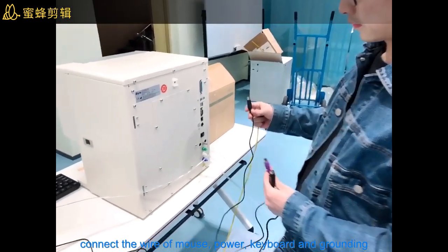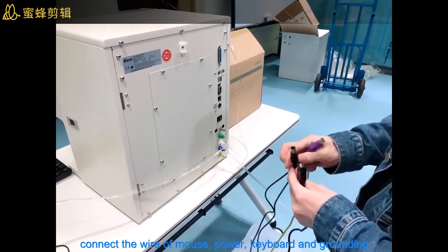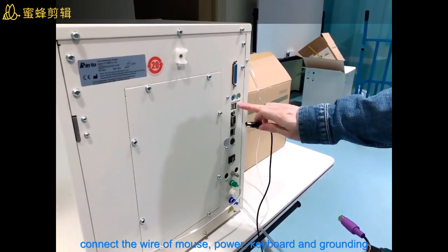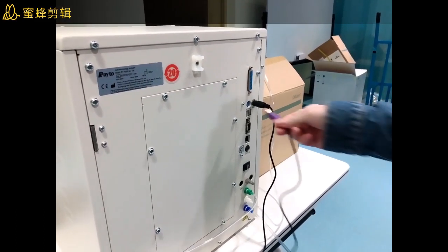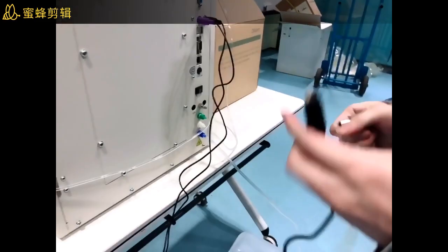Now the next step: we will do the installation for the mouse and the keyboard. We have different kinds of connectors, so you just put them inside the same color port. This is the mouse, and this is the keyboard, and this is the ground wire.